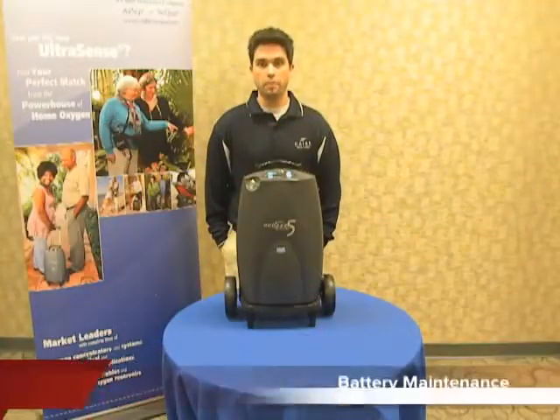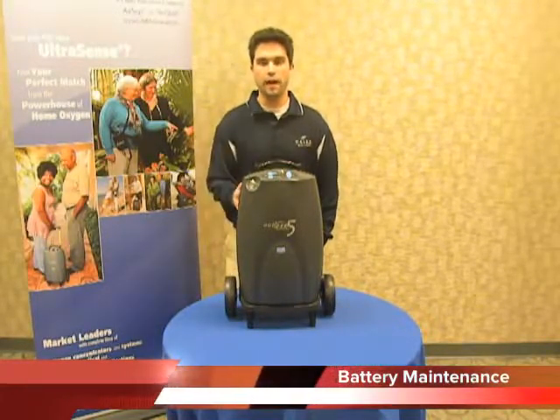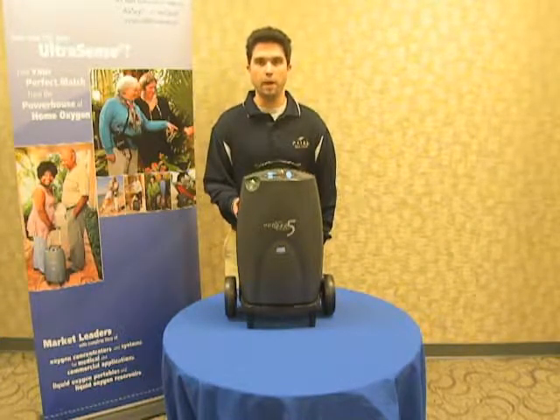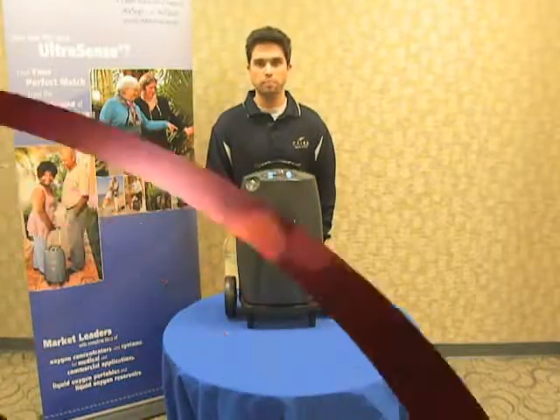As part of your maintenance of the battery, you will need to make sure you drain it completely until the machine dies and recharge it from scratch once a month. This ensures that you always get the highest and longest battery times possible and keeps your battery running for the longest period of time.